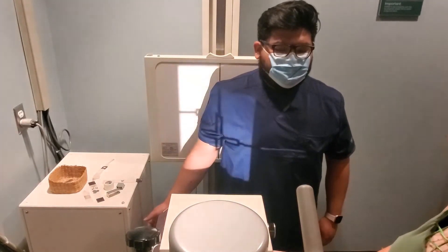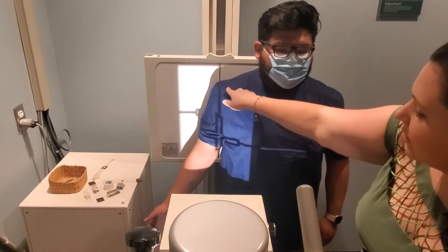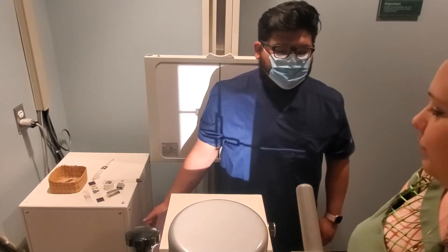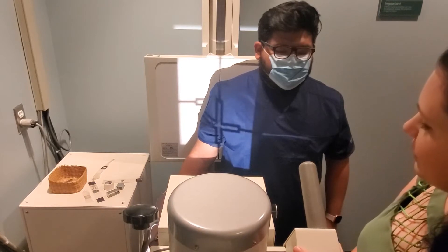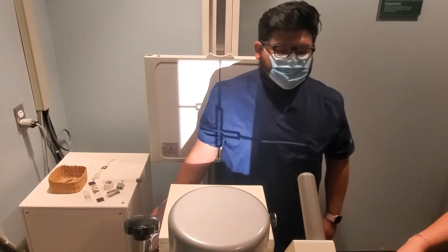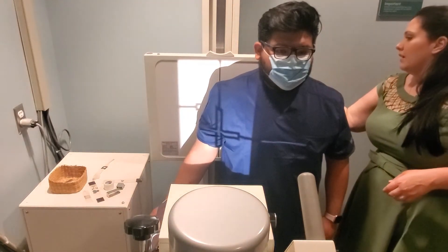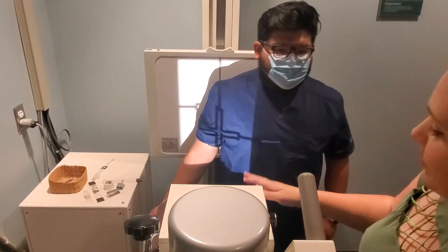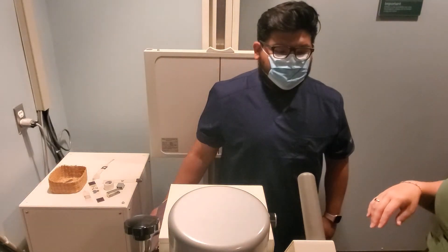Merrill's tells you to center at mid-humerus, but sometimes that cuts off the humeral head a little bit, so you can go up to about the one-third mark if needed to fit the full humerus in. Make sure you get about an inch and a half past both the elbow joint and the humeral head. Touch the tube, touch the bucky — if you move your collimator, move the light field to match.